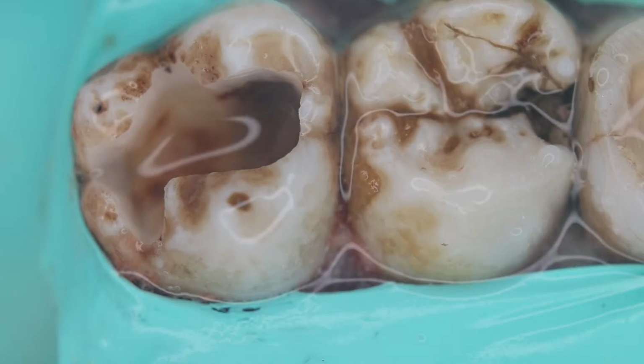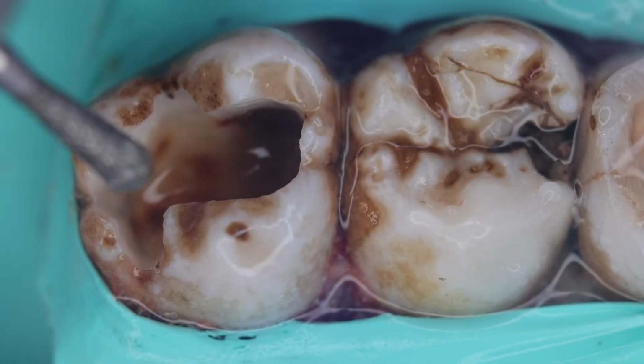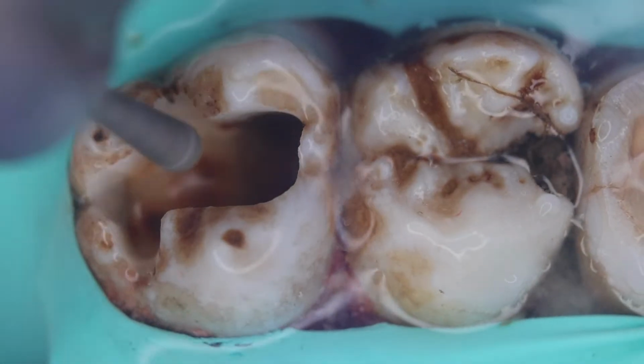So once we have removed all the caries, now is the time to round off the margins, so that there are no sharp angles. So we would round off the same.